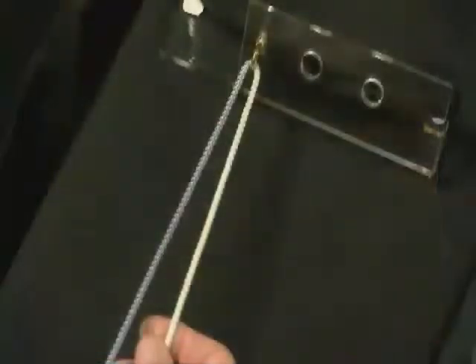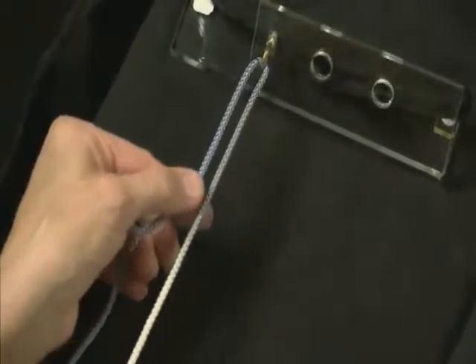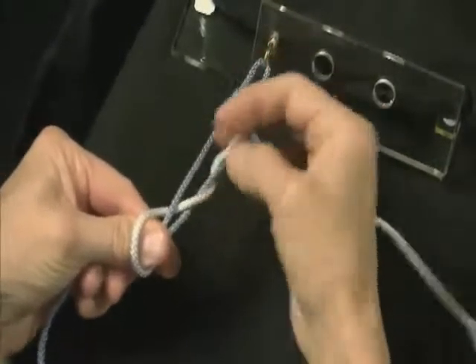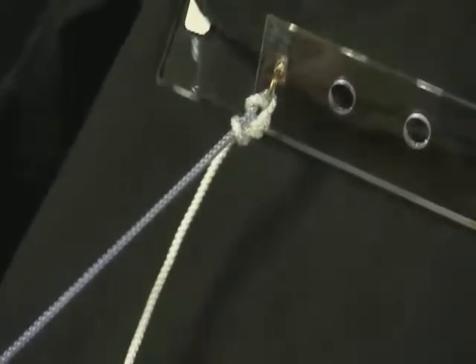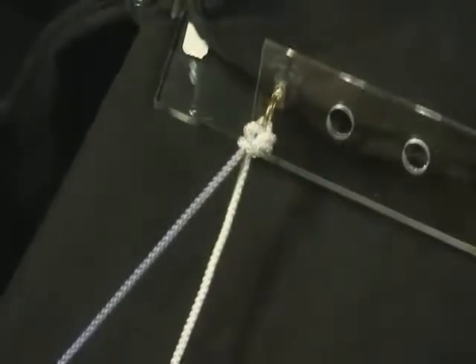Dr. Ireland demonstrates the Westin knot. The post is in the left hand — it's blue — with the wrapping limb here. Bring this down where the post is half of the other suture. Bring it over the thumb, over the wrapping limb, back through the loop. As you watch the suture come down, it's a sliding knot. Even up your post and wrapping limb, come down to the base, and as you pull on it, you can see it seats itself. With suture, it pretty much seats itself all the way.